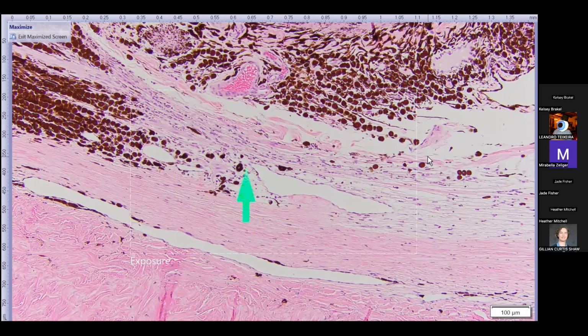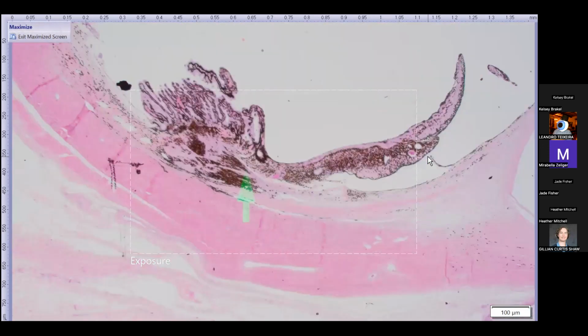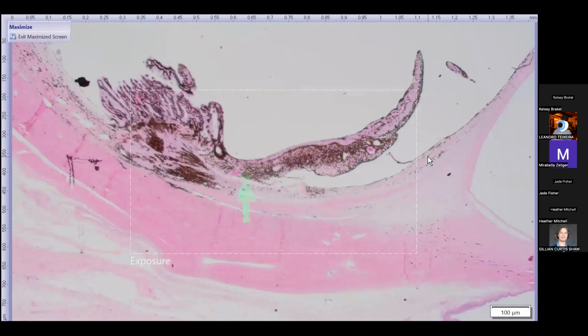So most likely what we're looking at here is during the initial trauma for this dog, the iris and the ciliary body, let me get that in better focus, okay, the iris and the ciliary body would have peeled away or torn away slightly from their normal anatomic location. And then that space over time filled up with fibrosis, so scar tissue basically. And so when the iris and the ciliary body tear away from their anatomic location like that, it's called cyclodialysis, which is pretty much just calling it like it is: dialysis, tear, of the ciliary body. So tearing of the ciliary body.